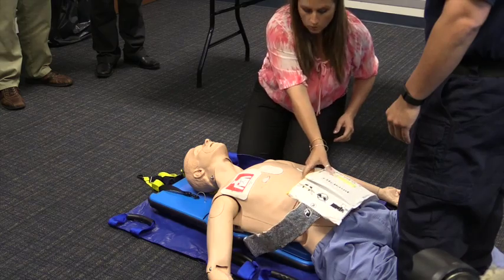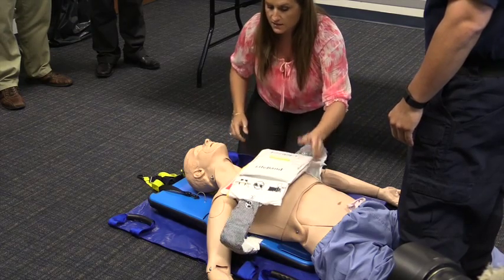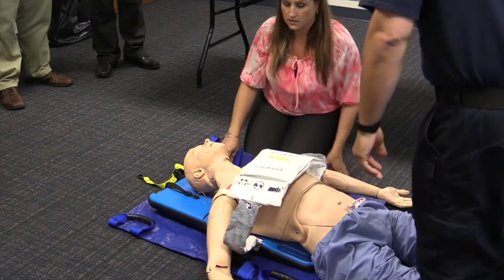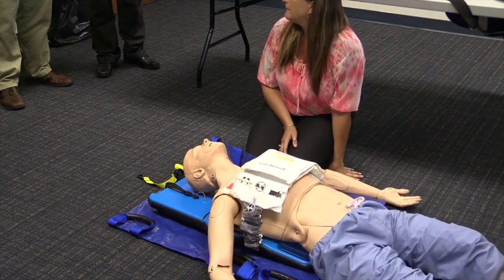When you consider that and think about all the technology, the mechanism, and how it works, of course it's going to provide better CPR — better blood flow, better blood pressure, better pulse rate.